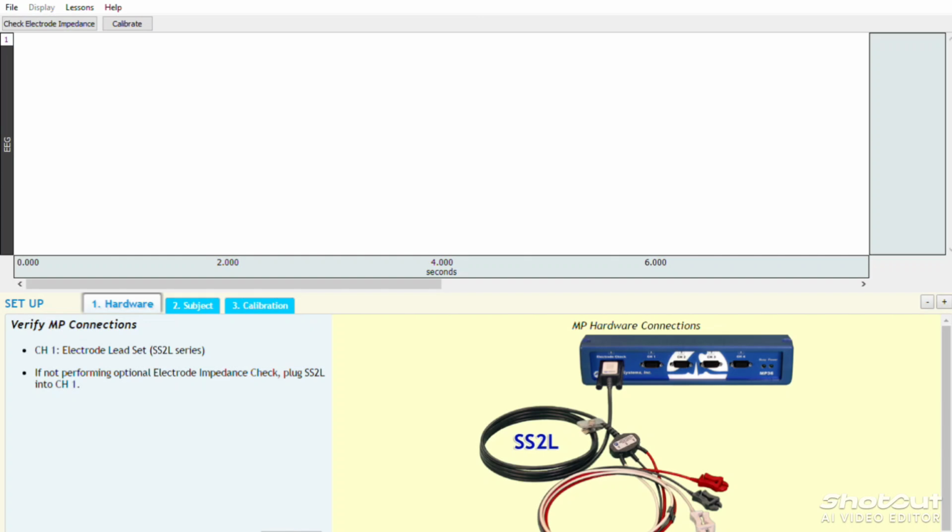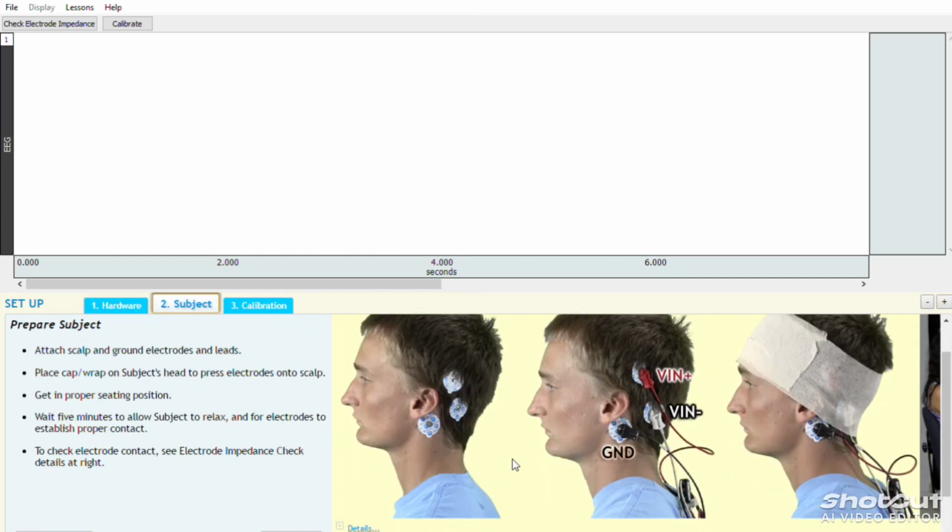Here you can see we need to connect the electrode for measuring the EEG, but we use the electrode on the forehead of the subject. When performing the experiment we need to clean the area of the subject where we connect the electrodes, and many students have heavy growth of hair.